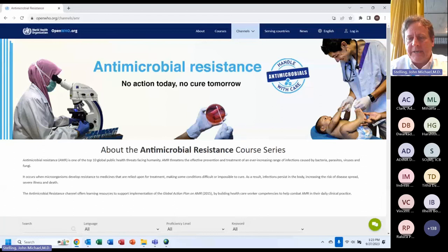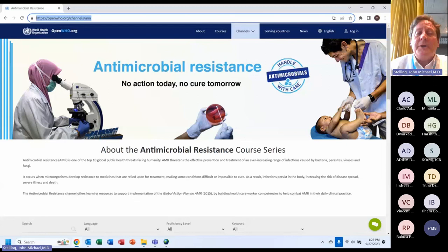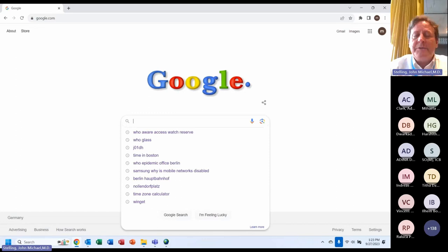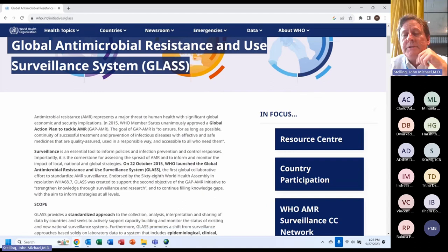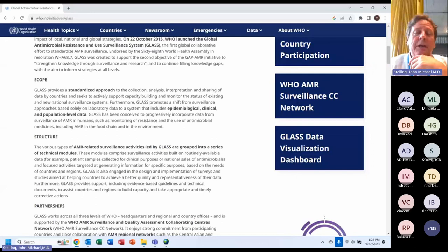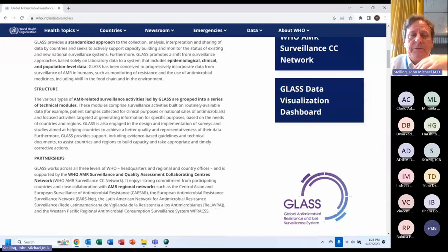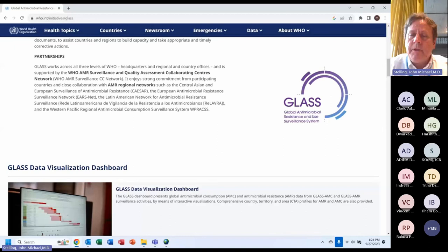Now moving over to GLASS. I just search for 'WHO GLASS' on Google — it's the first link that comes up. Here you can see information on past reports, analyses, how a country can join, and the WHO AMR Surveillance Collaborating Center Network, of which we are a member. There was a webinar last Friday on GLASS, and that will eventually be posted here once video editing is finalized.